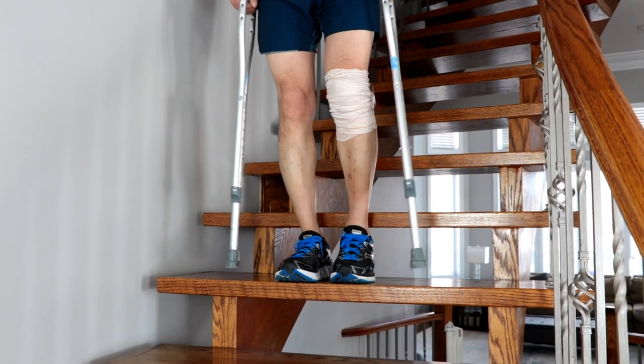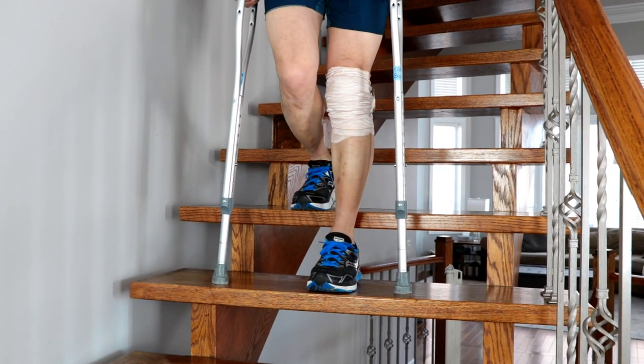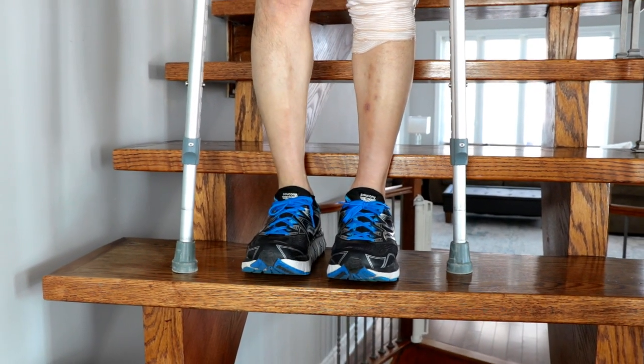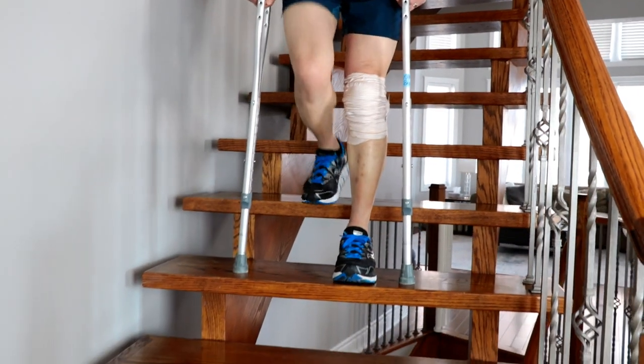Begin by standing on the strong leg and lowering the crutches and injured limb to the stair. Once you have the crutches firmly planted on the lower stair, you can move the strong leg down to meet them. This cycle repeats until you're at the bottom of the stairs.